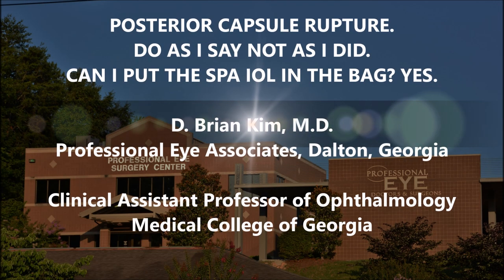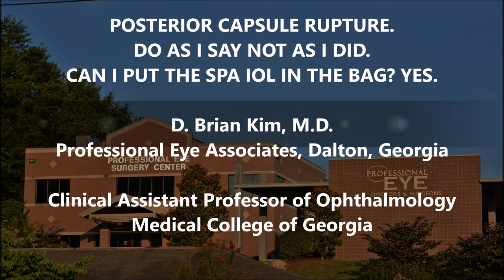Hi, this is Brian Kim. I'm going to share with you this case of a patient who had posterior capsule rupture. Do as I say, not as I did. But thankfully, this patient did quite well. You'll see the maneuvers that I made once I recognized the posterior capsule rupture and how I was able to manage this, still put the lens within the capsular bag, and avoid needing to do a vitrectomy.